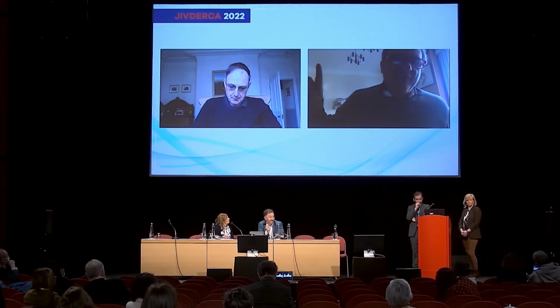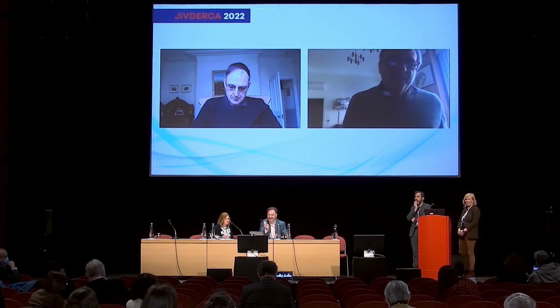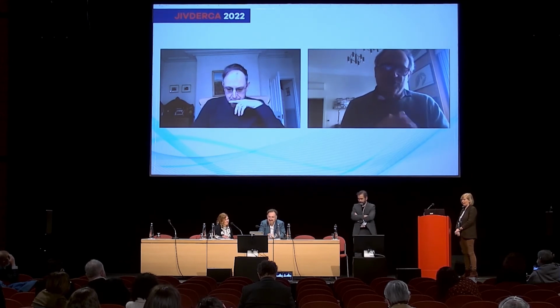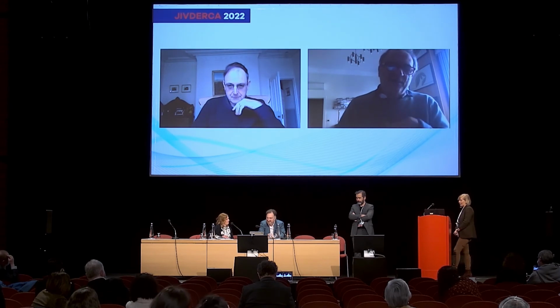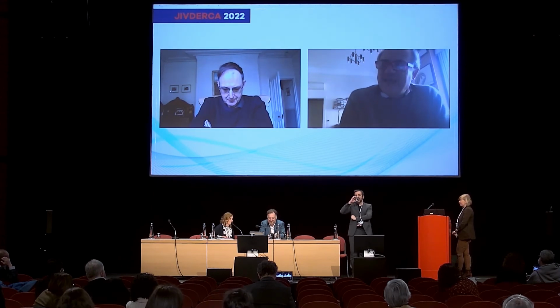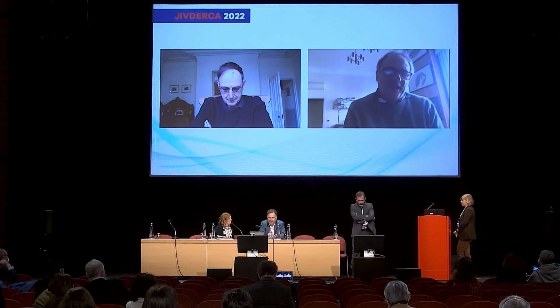Can I ask you something? Can you hear me? Yes. Stefano. Yeah, I had a question for Annalisa and a question for Jesus. Jesus, I respectfully disagree with the fact that you described the Pisani paper as a CPAP effect. Actually, Mudel has nicely shown that CPAP is totally different compared to high flow, because while high flow increases the expiratory resistance, CPAP does not increase expiratory resistance. So the mechanism by which high flow changes the breathing pattern could not be related to the CPAP effect.